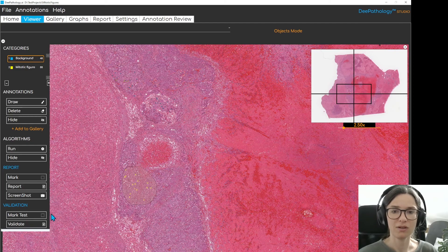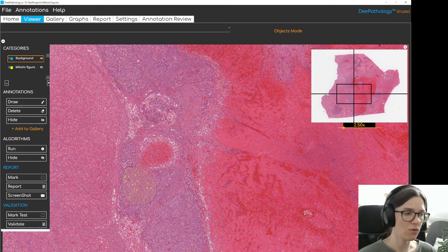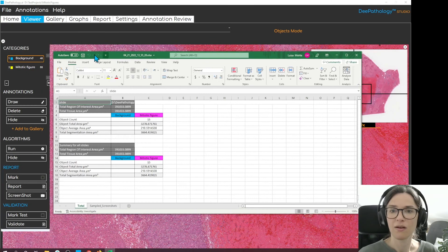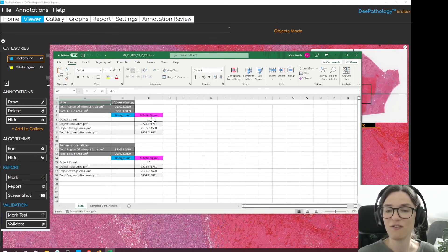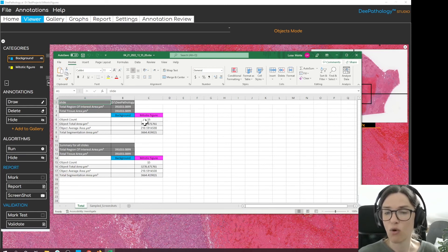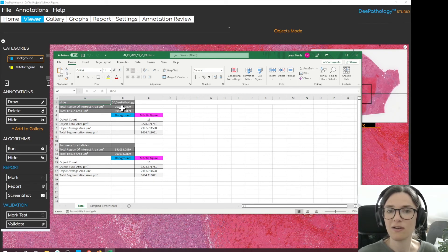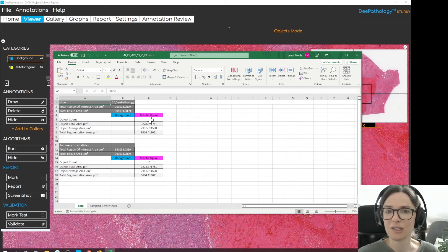Here is what the report looks like. It has counted 15 mitotic figures. You get information about the overall size, the average size, and how big your region of interest was, so you could calculate the mitotic count per square micrometer, for example.